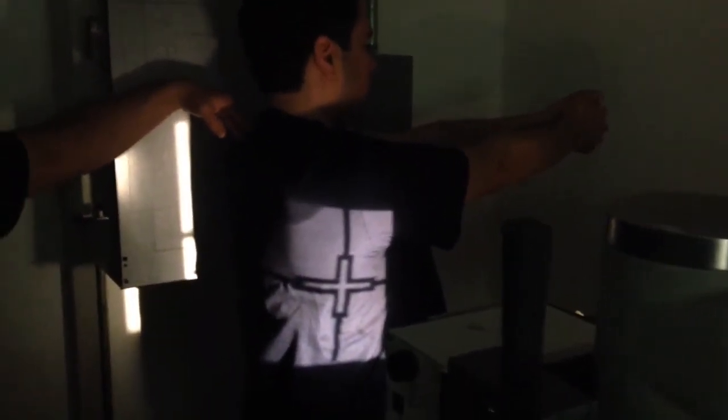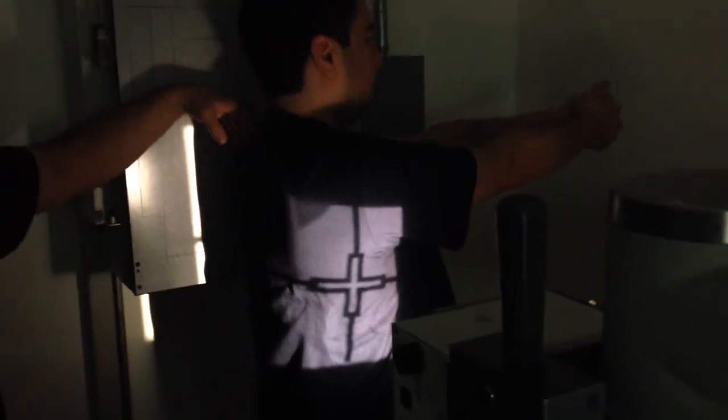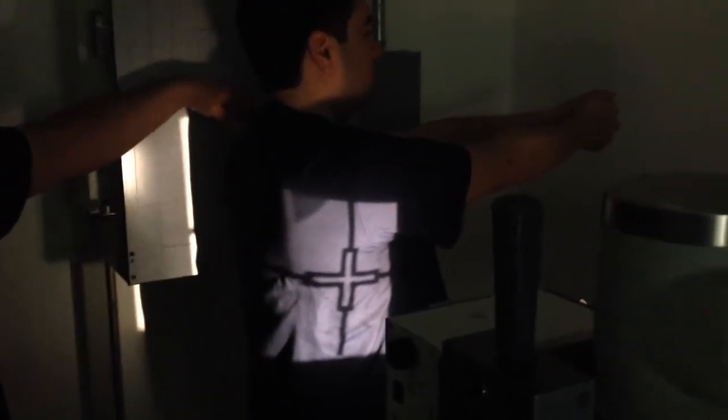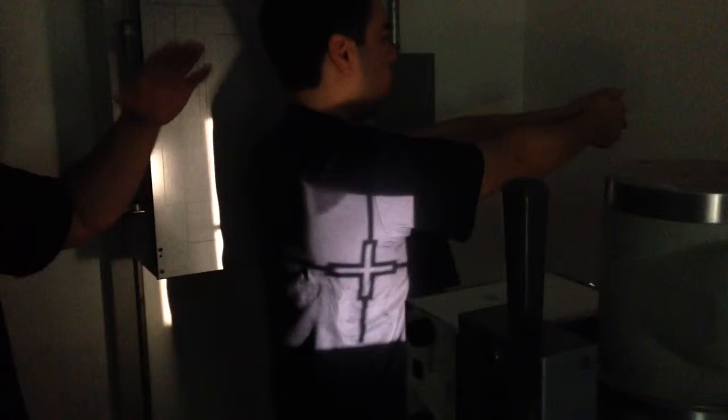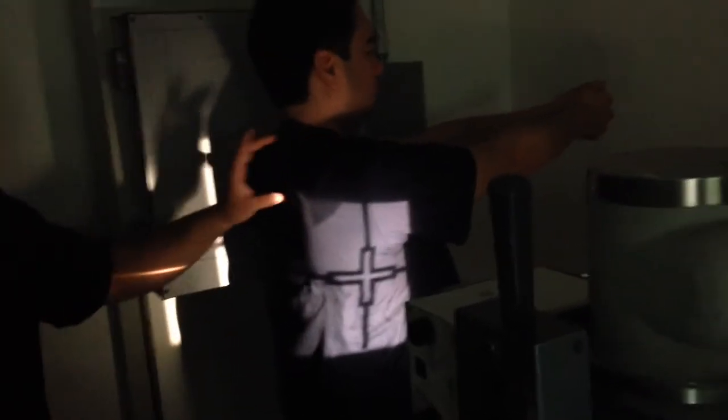Now, always get the posterior spinous process, because remember, you have to include the posterior ribs, because that's how we tell rotation. Now, the breathing technique for this is going to be short, shallow breaths. Make sure you add that onto your cards. Short, shallow breaths. One of the eval criteria was that the first 3 vertebrae aren't really seen. So we're not too worried about 1 through 3 because they're not well visualized anyway. That's why we do the upper one.